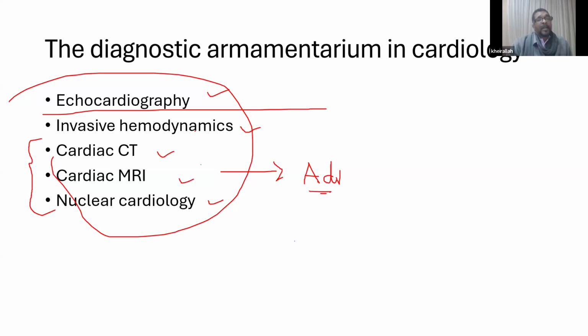Invasive hemodynamics are needed in a very exceptional situation when the echo is uncertain or ambiguous or doesn't give the answer.